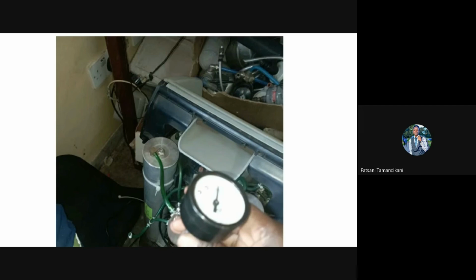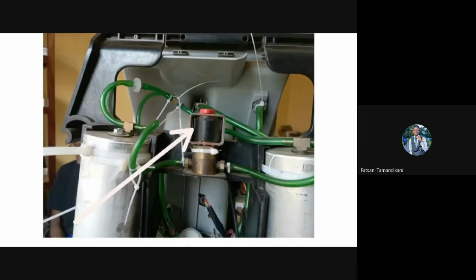Moving on, we'll go to equalization pressure. Equalization valves basically open, thereby allowing some pressure to be transferred between the sieve beds. This is done in order to balance the pressure on the sieve beds and to aid in the purging of nitrogen from the idle sieve bed to the other. In the graphics, you can see an equalization valve for an AirSep concentrator.